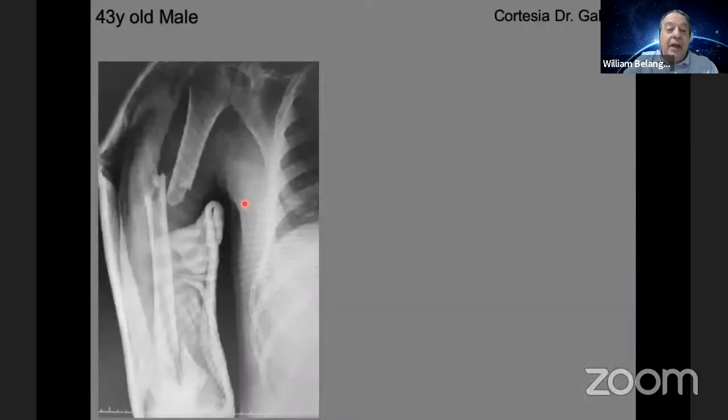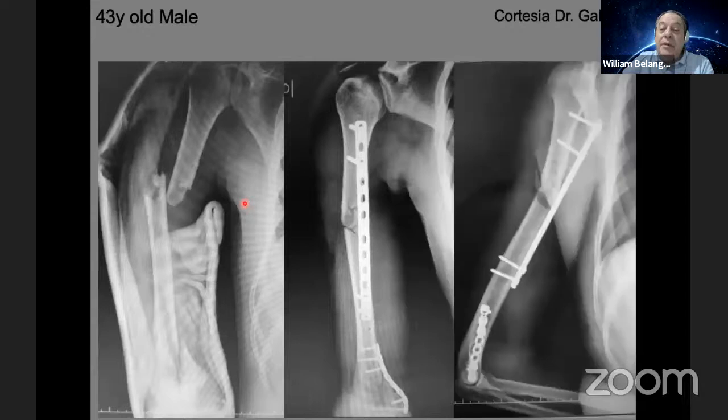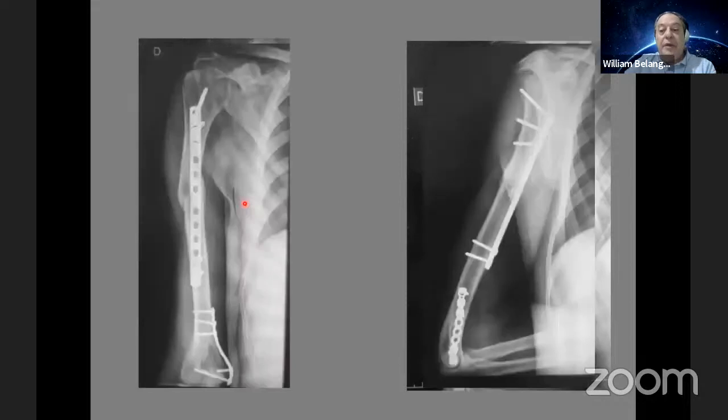You see another case, this is from my resident. It's a very short proximal fragment fixed with 2 screws, you see, and you see the pull-out. I recommended in this case to change it and to put another long screw, 3 screws to fix the fracture, and the fracture healed completely without problem.